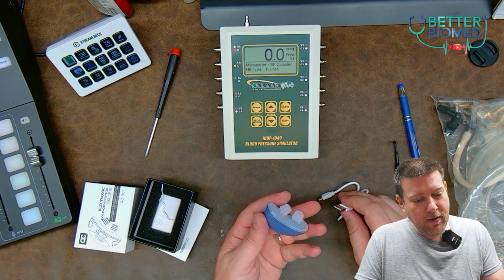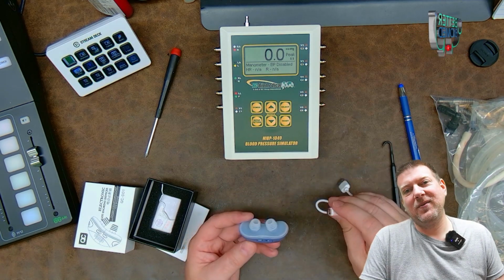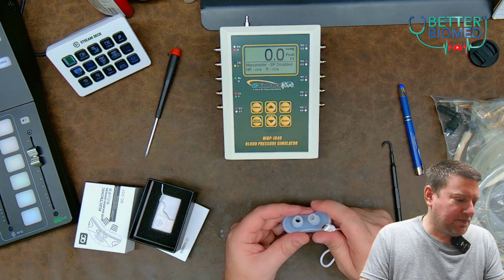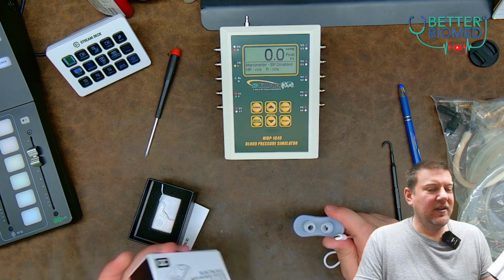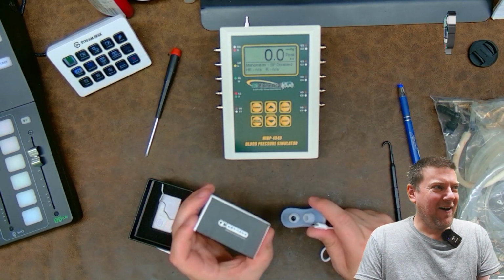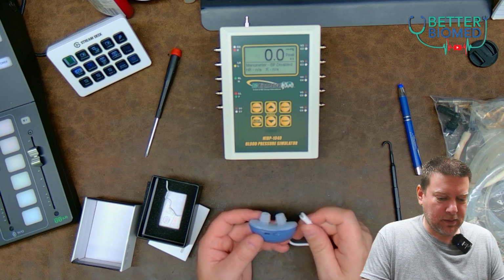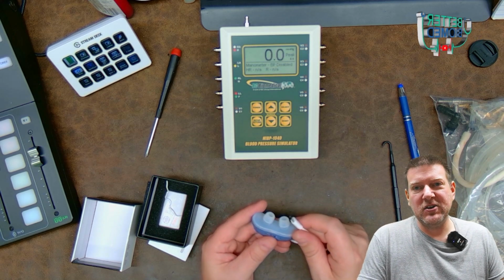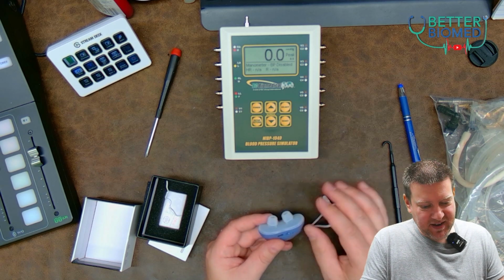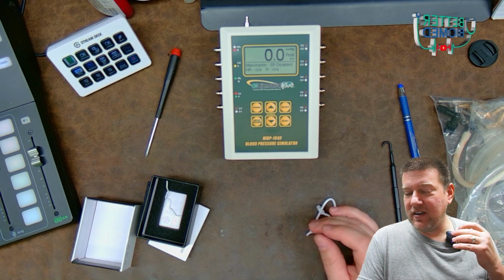And interestingly enough, why is it that all fine products that emanate from, well, countries with that kind of writing on them, all fine products like that have USB mini and micro? USB-C, it needs to happen, folks. So anyway, it is on. You can hear it.